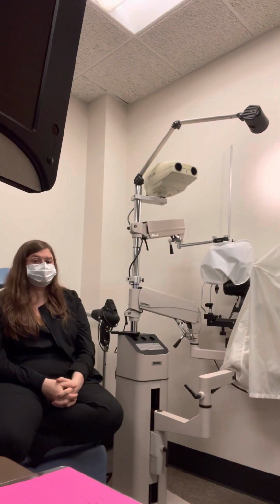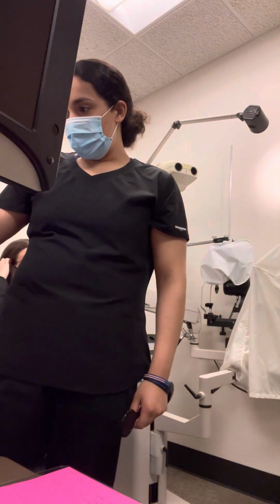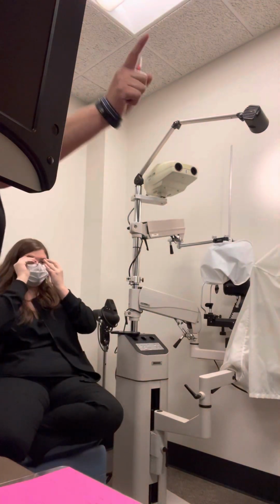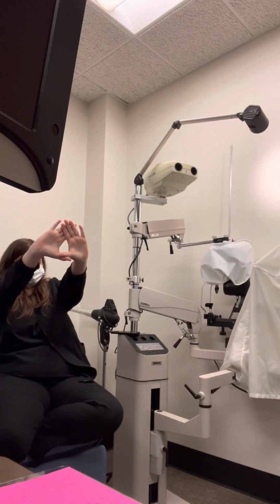Okay, so what I'm going to have you do is make a triangle with your hands, and give me one second here. Hold on. I'm going to have you cover your left eye. And I'm going to flash one. Okay, so you're going to center that E in the center of your triangle. Okay, and I'm just going to cover your eye. You're going to let me know if you see the E or not. Okay? Do you see it?